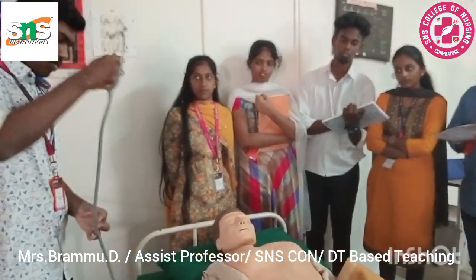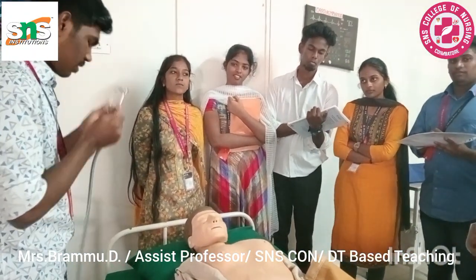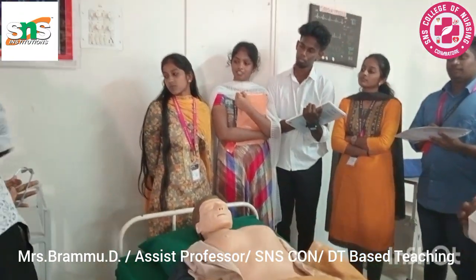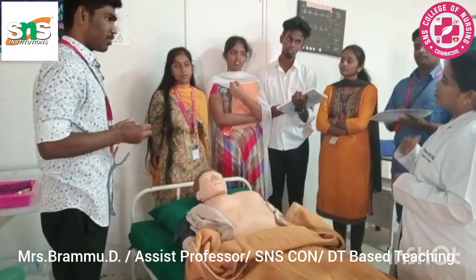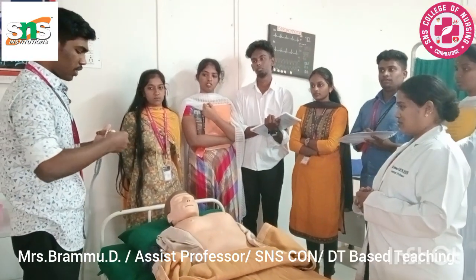Take the stethoscope. Always disinfect before you use the stethoscope. If it is your own personal one, then you can use it. Otherwise, use cotton buds to clean it.